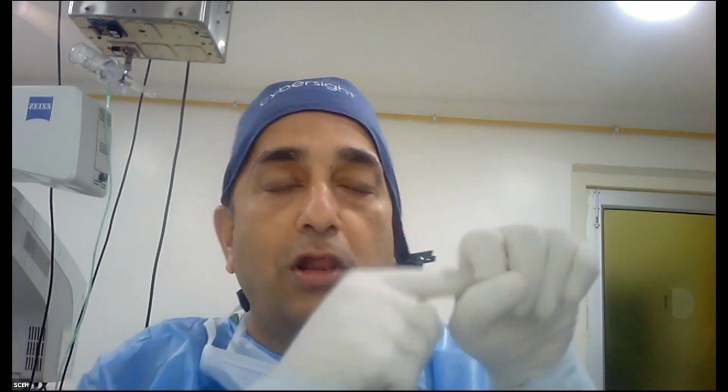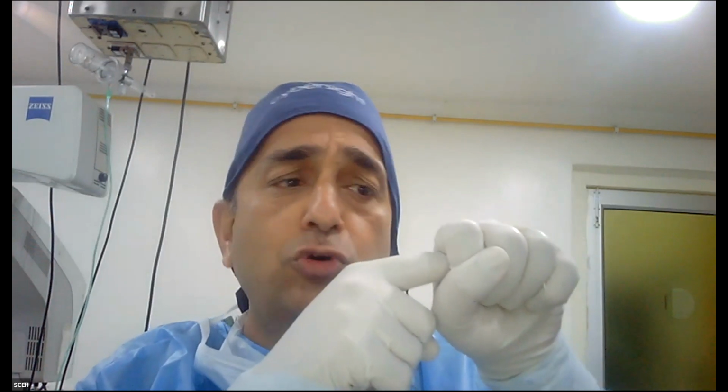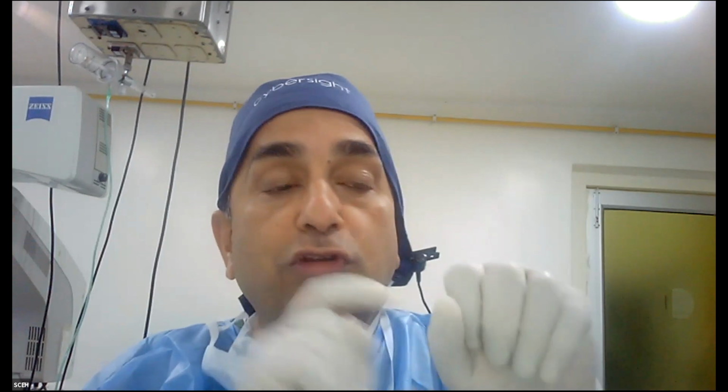The problem with the torsional is that you can imagine that it's drilling a hole, and sometimes the piece gets stuck like that. And so to dislodge it, you either need your second instrument to dislodge it so that a better position is presented, or you need a burst of longitudinal phaco to unhook it from there. And that is what is called IP.